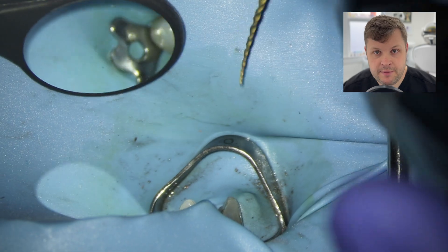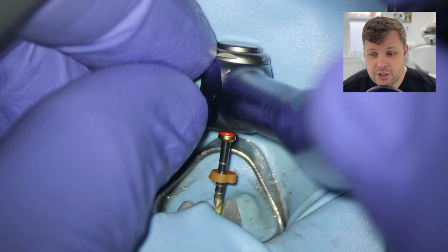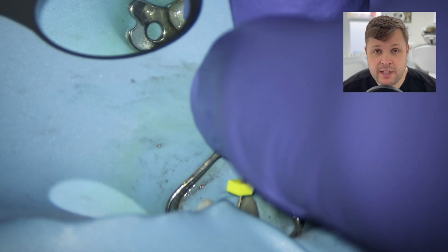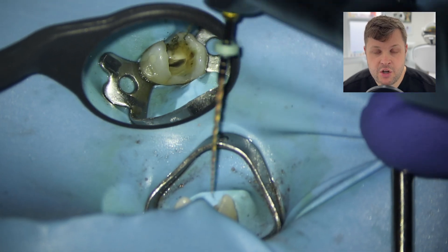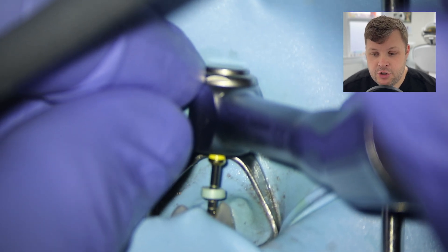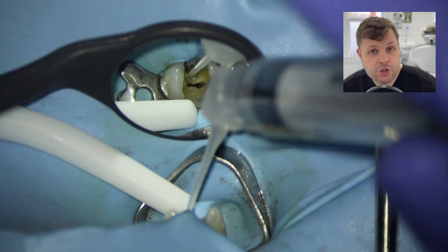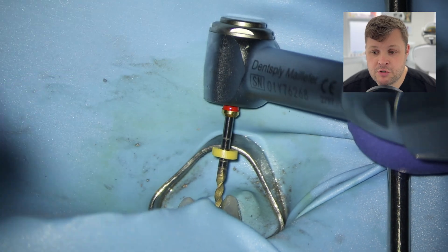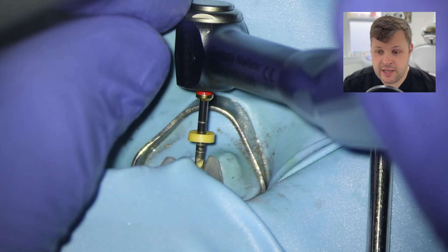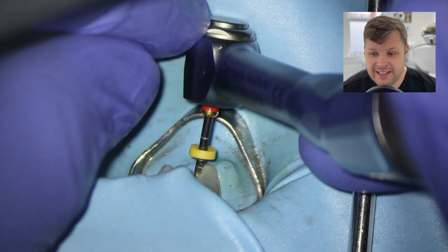I want to use the size 25 HyFlex to finally shape this, but it's getting stuck and not advancing. So I recapitulate with the size 10 D-Finder to confirm I'm getting to length with no obvious ledge, then drop down to a size 20 hand file which does just manage to reach past. Back with the size 25 HyFlex in T-mode — gentle watch-winding past that difficult point, then turning on the rotary to shape it all the way out.